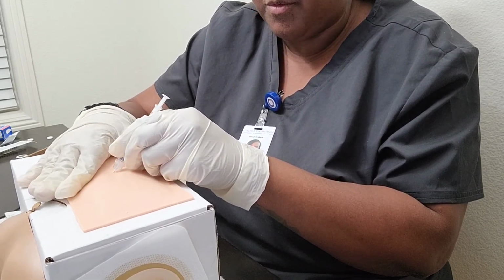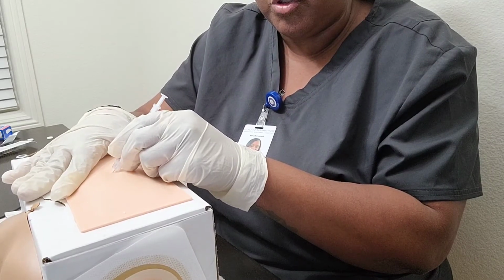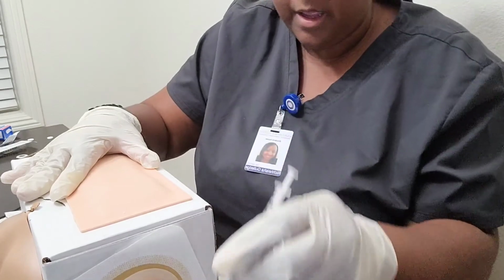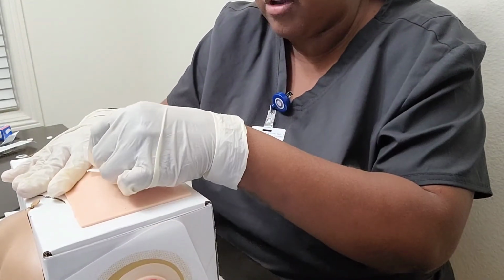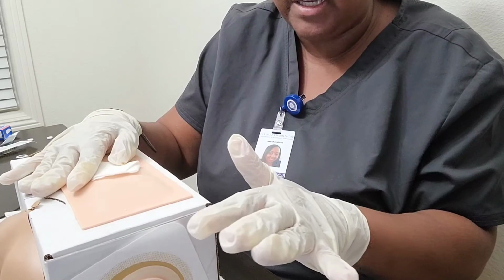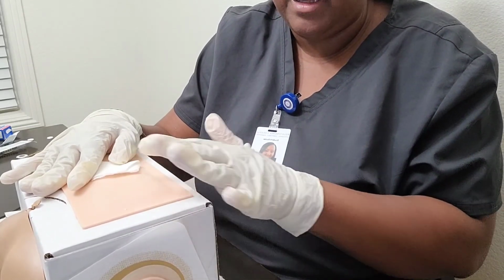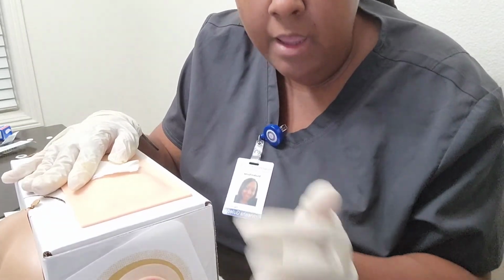And then I'm going to release that skin, and then I'm going to withdraw the needle very quickly, and then I'm going to go ahead and place my gauze pad gently over the site. I'm not massaging it, and then if it needs a band-aid, I will go ahead and put a band-aid on it.